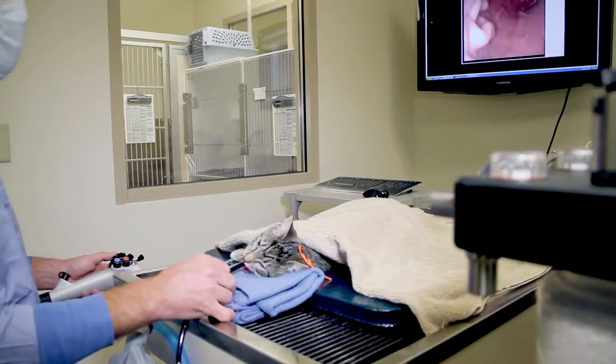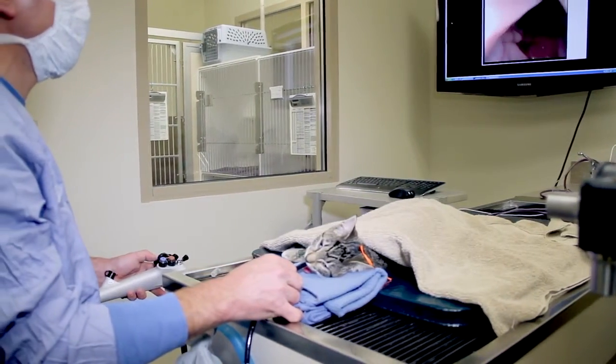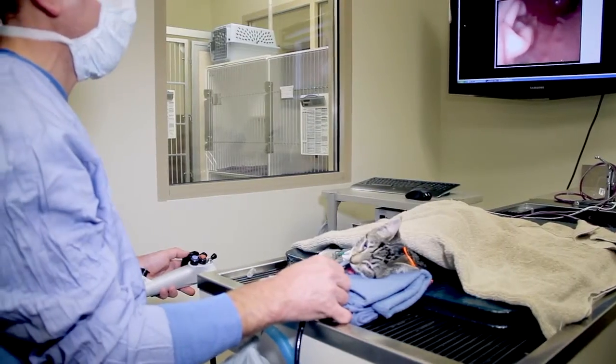You're using a scope to look into something, which is by definition what endoscopy is. We could find a foreign body or a tumor or a really bad infection. But that's also a therapeutic tool, because we can also use that camera to get a biopsy and possibly remove a foreign body if we find a cheatgrass seed, for example. So it's a diagnostic and a therapeutic tool.